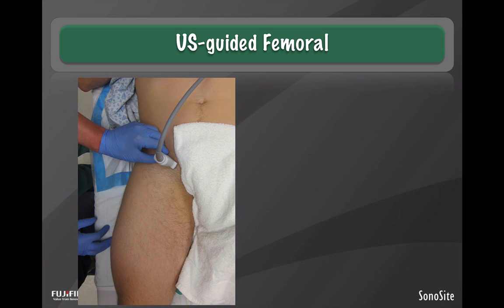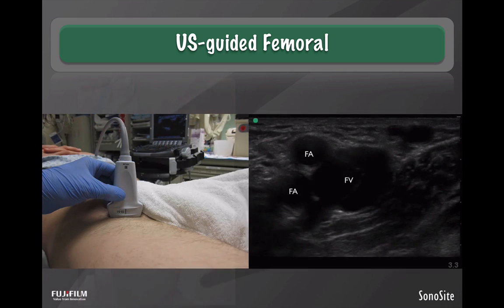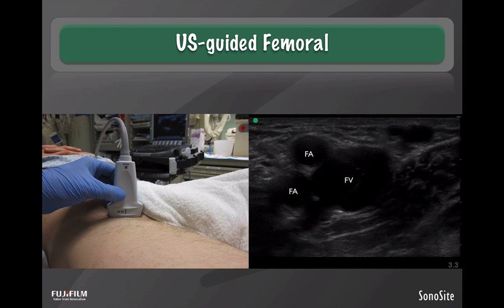You're going to, again, put the ultrasound transducer in the inguinal ligament, probe marker facing laterally, kind of facing toward the umbilicus. And you can see here, you're going to visualize on the right, the femoral artery bifurcates first, and there's the femoral vein. And for all those people that have ever cannulated a femoral vein blind, which I've done numerous times when I was a resident and couldn't slide the wire in, I think you're puncturing that little vessel up top. That's the saphenous.